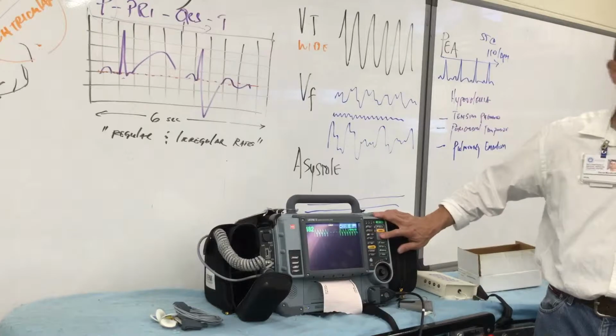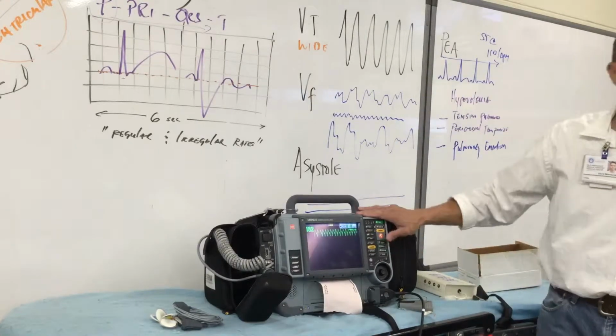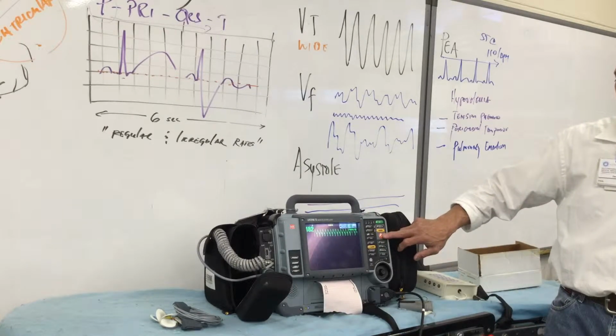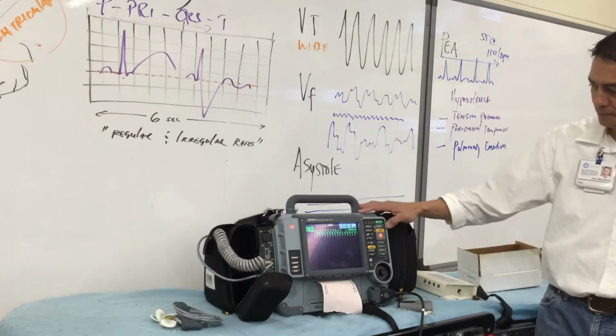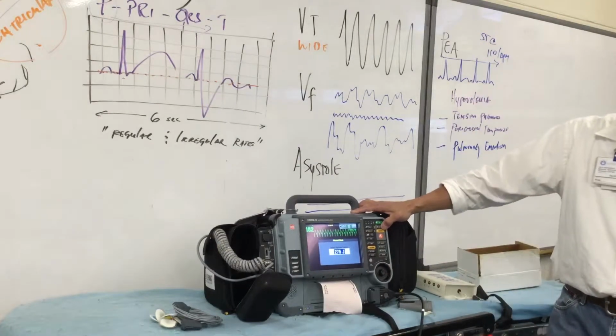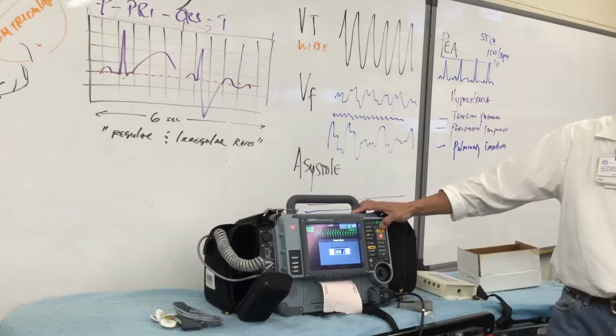Subsequently, after we press and defibrillate the patient, we continue to do compressions, working in our 2-minute cycle. And then when we press charge again, it would go automatically up to the next energy setting at 300. So you'd see it defaults already to 200. The next time it'll go up, it'll default to 300 and so forth. Up to 360 is the max.